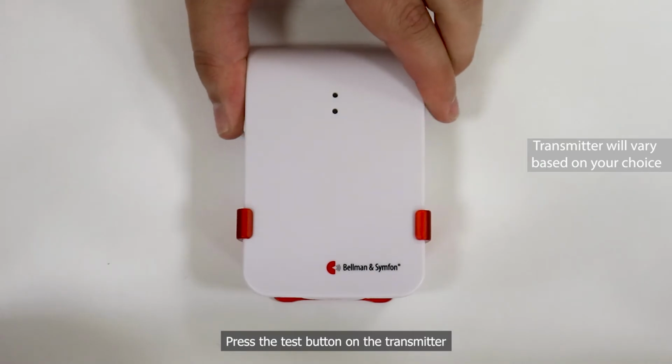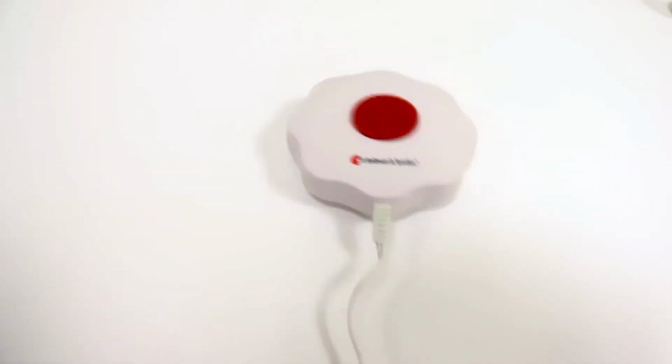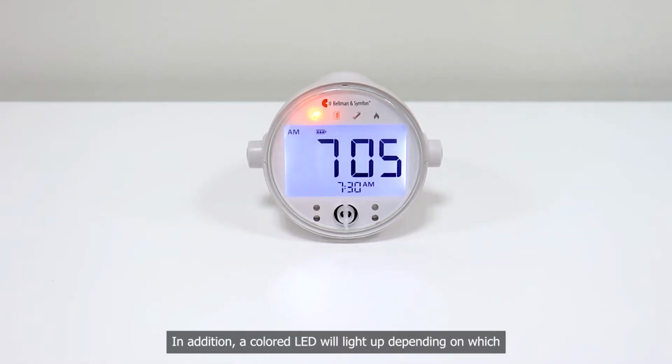Press the test button on the transmitter. The 4 high-intensity LEDs start to flash, sound, and the bed shaker will vibrate. In addition, a colored LED will light up depending on which transmitter has been triggered. To stop the notification, press the snooze button on the top.